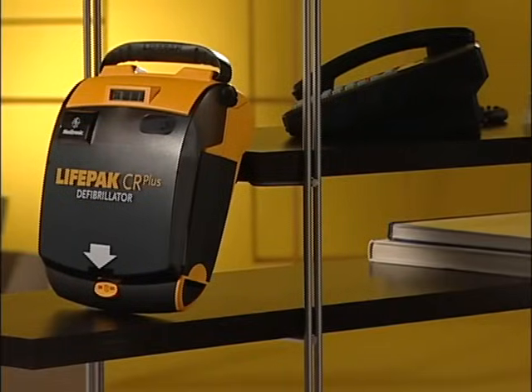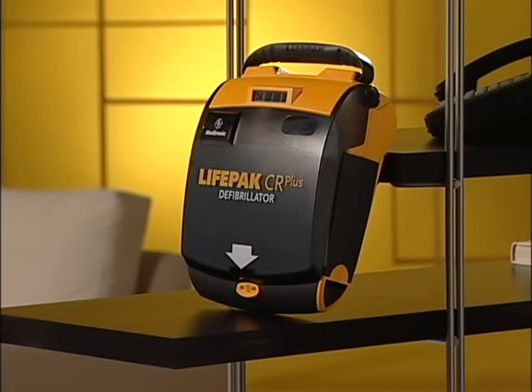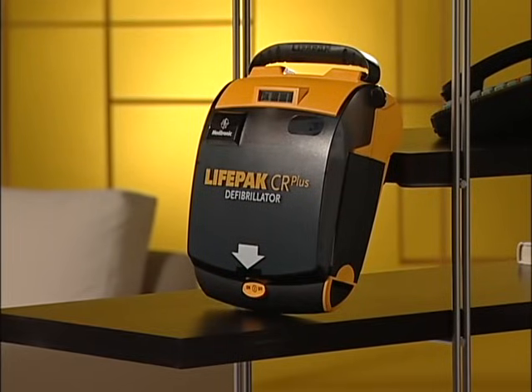And finally, where to store the LifePak AED. You should keep it in a central location, preferably near a phone so you can call 911 while you're getting the AED. Put it someplace where it's easy to see and easy to grab in an emergency. Make sure everyone knows where it is, and if you take it out, be sure to put it back in the same place. So there you are.